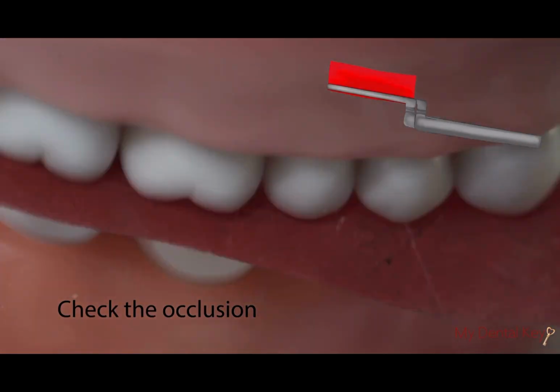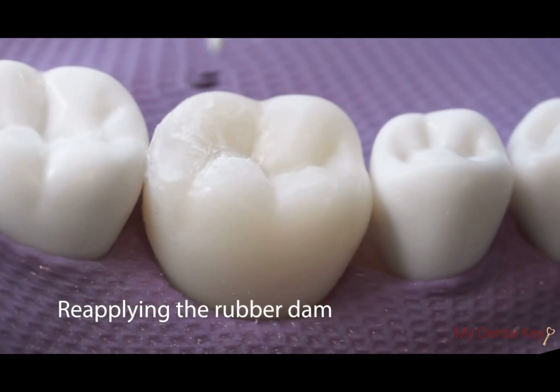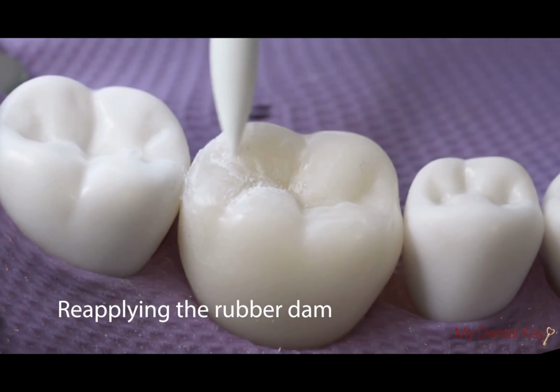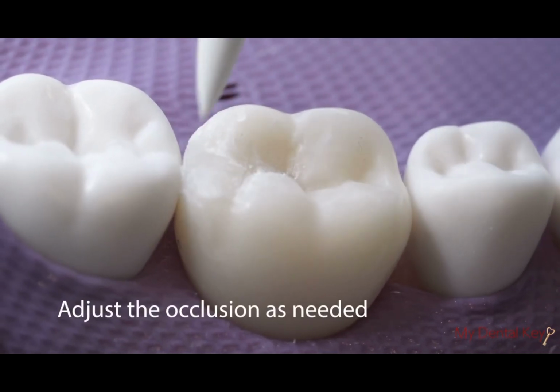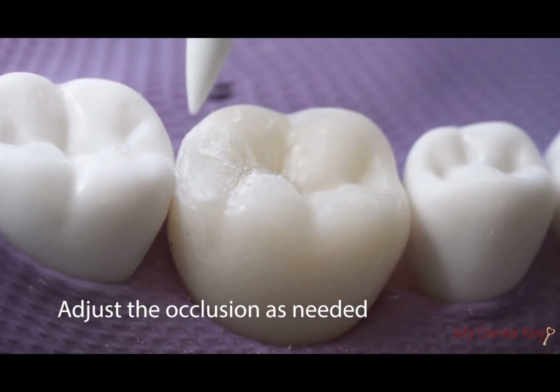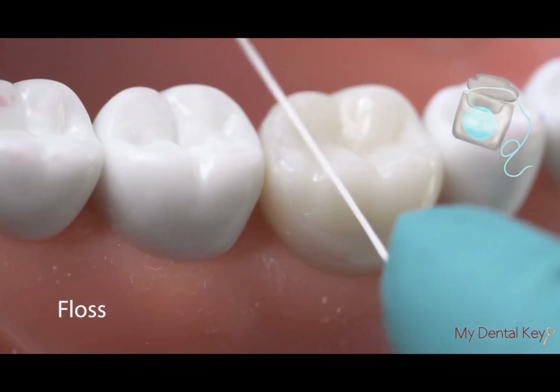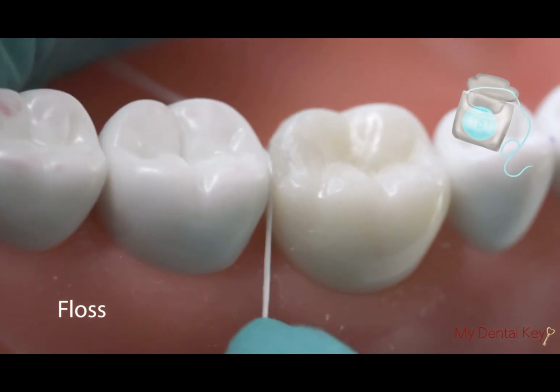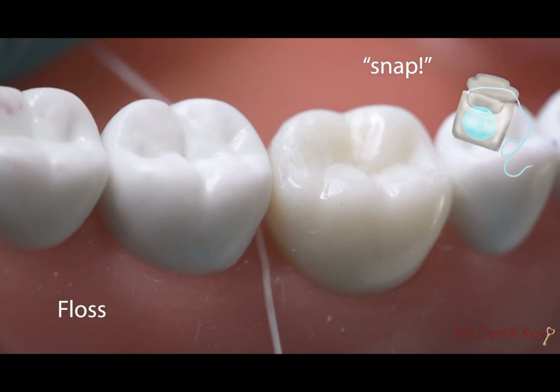Check the occlusion using articulating paper. Depending on your examination site, any use of rotary instruments may require the reapplication of your rubber dam. Adjust the occlusion as needed using rotary instruments, high speed with water or slow speed, until appropriate articulation is achieved. Floss up and down in the contact area of the restoration. An appropriately closed contact produces a slight snap sound when the floss passes through.